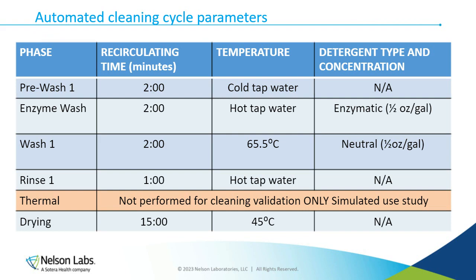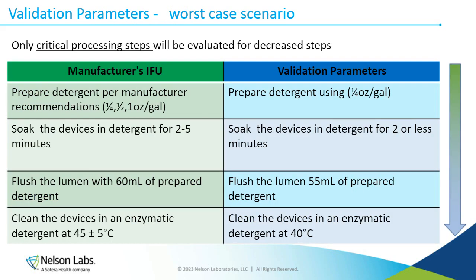One thing to remember is for automated cleaning, the thermal phase of the cycle is part of your IFU, but we don't use that for cleaning validations because that is a disinfection validation. So that phase will be omitted from the cleaning validation. It's only used for simulated use cycles because we are mimicking what's happening in hospital practices. So something to keep in mind when validating these devices.